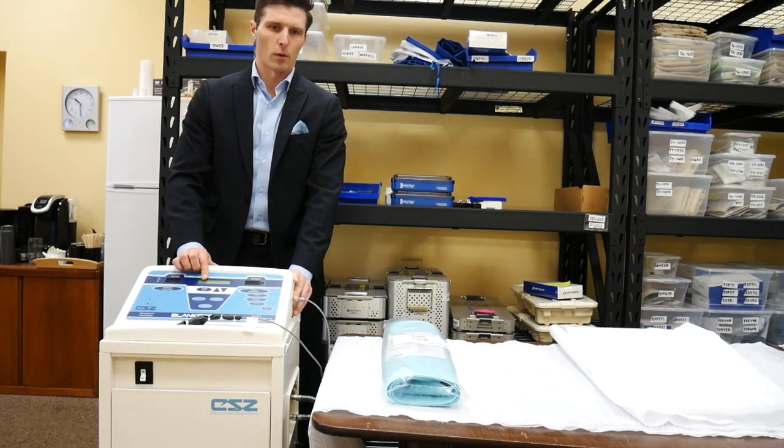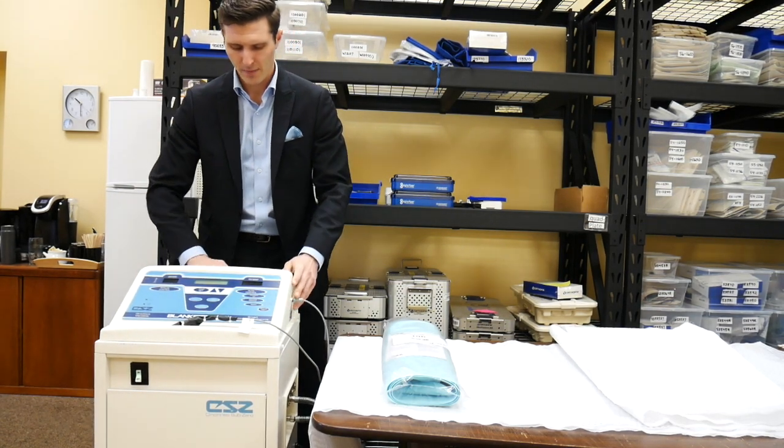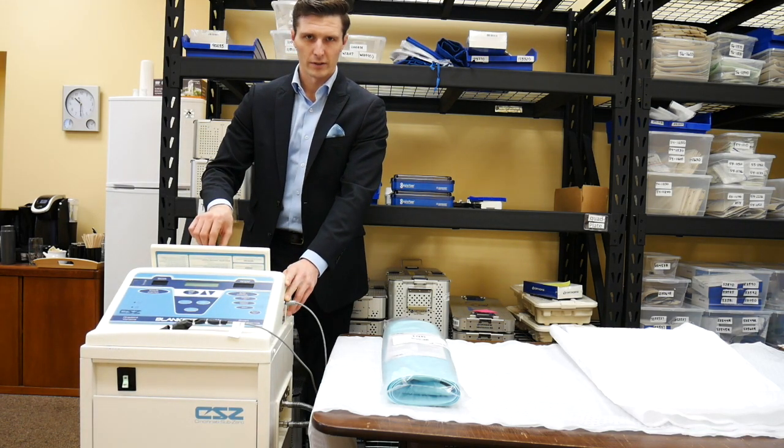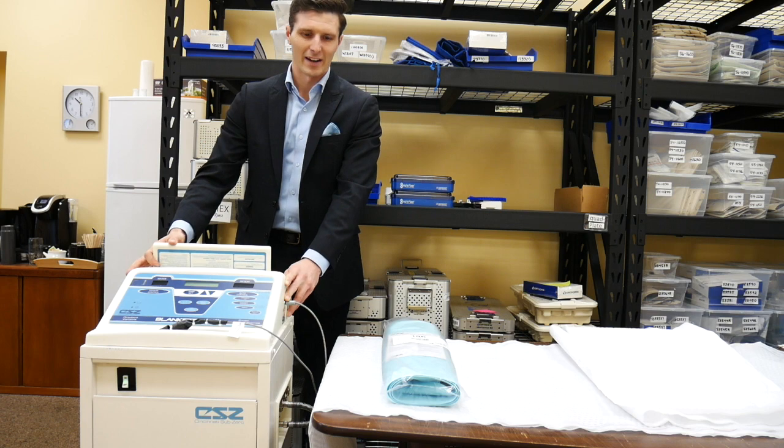Or more difficult things that may require PM or service right away. At the back of the unit, you'll find a water reservoir. Open up this flap, pour sterile distilled or sterile water only — seven and a half liters.